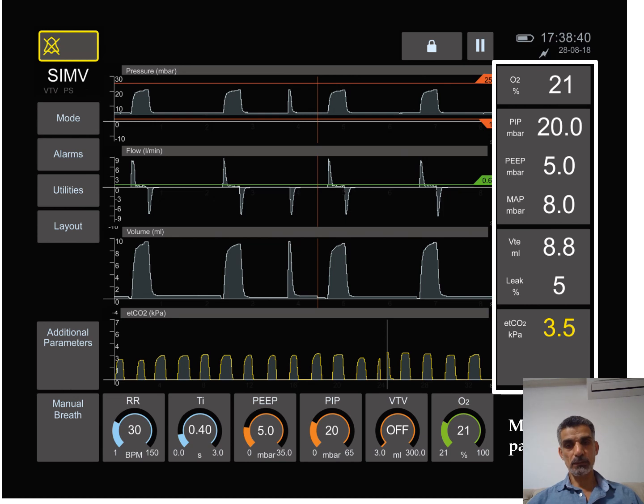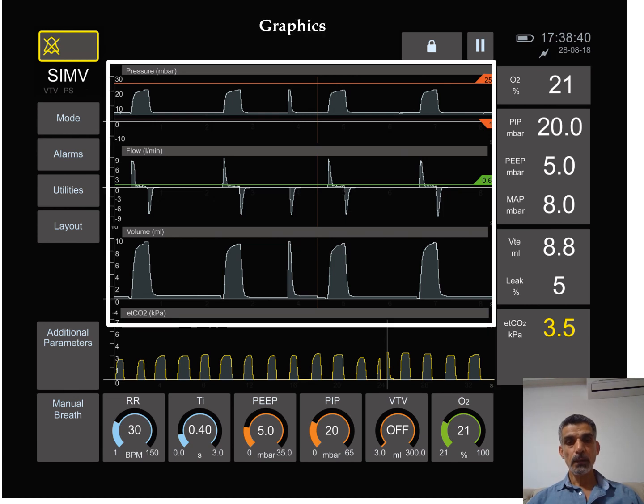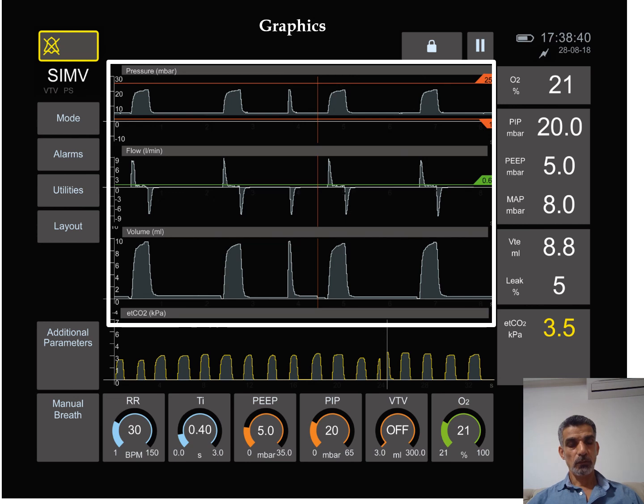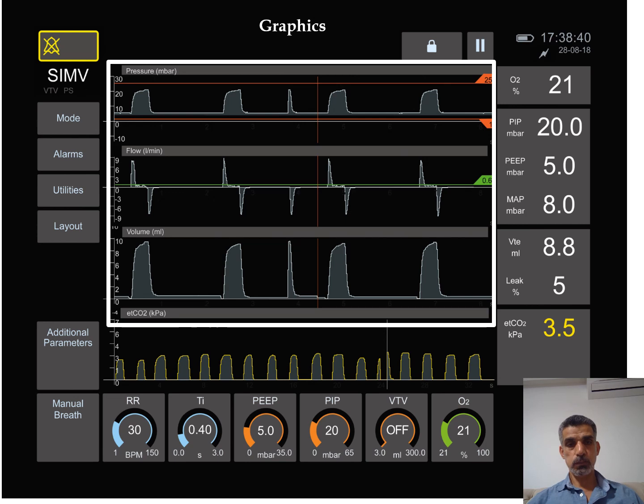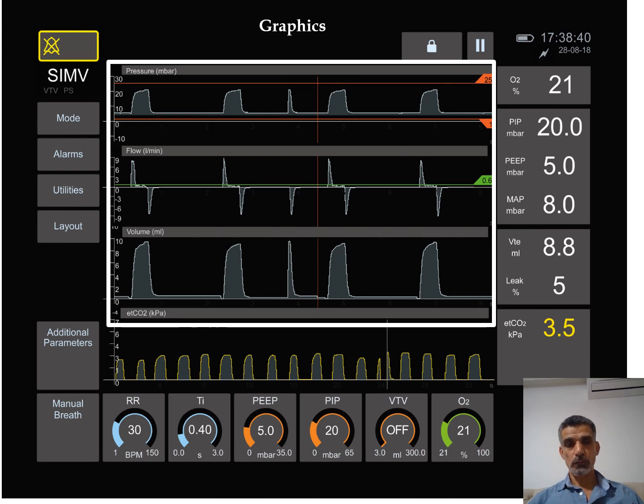The ventilator also shows the graphics, which is the change of different parameters with time. So we can see the volume graph, we can see the flow graph and the pressure graph. And you can see the volume is always positive during each inspiratory cycle, while the flow has positive inflow and negative outflow inside the lung, going inside the lung, going outside the lung.